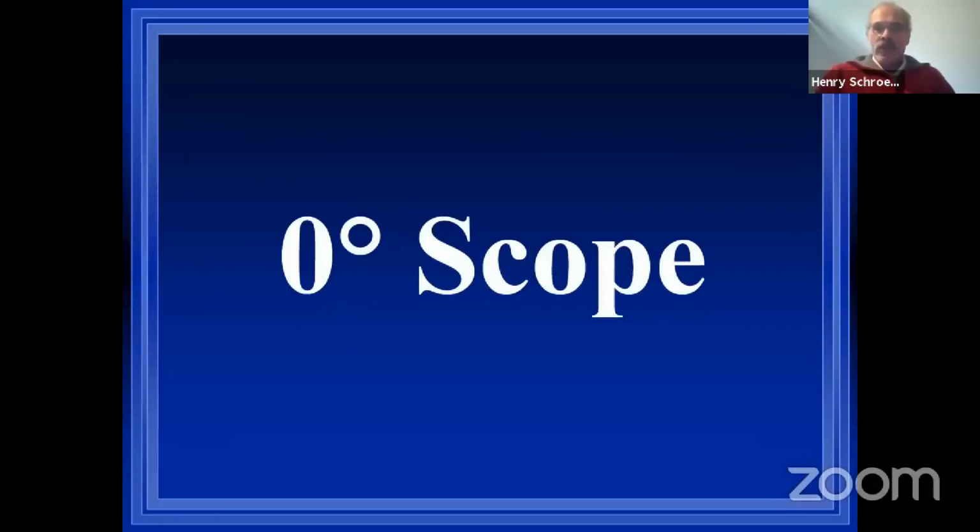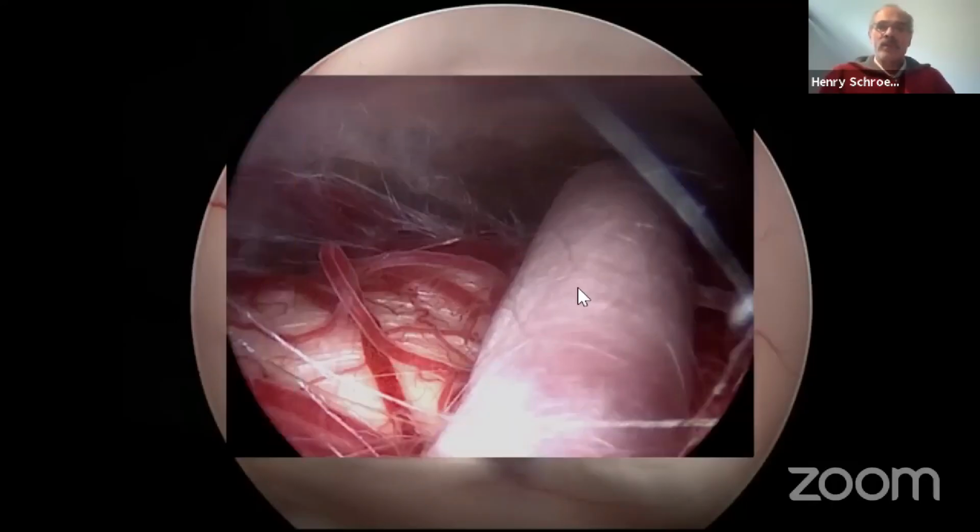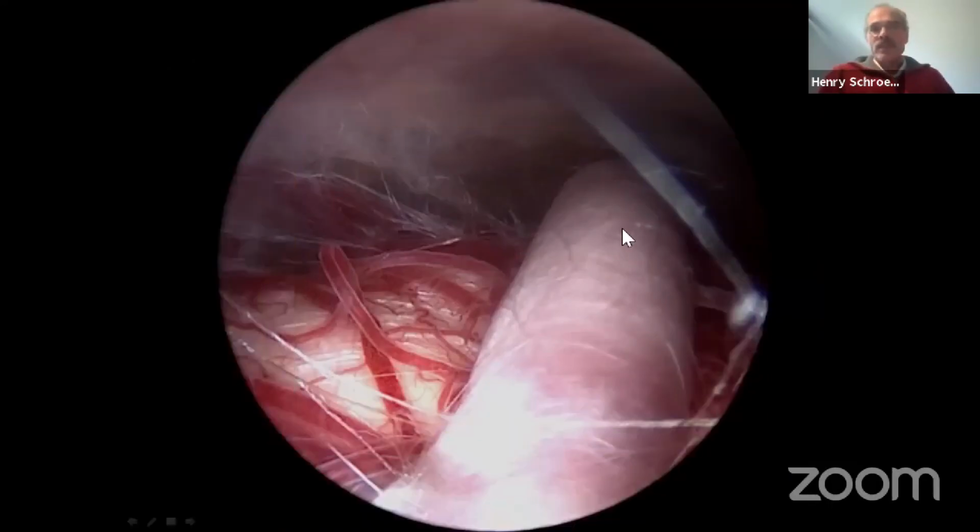When we look through the third ventriculostomy, we come to the prepontine space. You see this, our ETV. Usually it should be in midline, halfway between mammillary bodies and infundibular recess, just behind the clivus. And when we look in, after ETV, you should see the basilar artery. If there's arachnoid over it, then you are in a subdural space and it's not good. You have to open up the subarachnoid space and you see all the small perforators coming from the basilar.